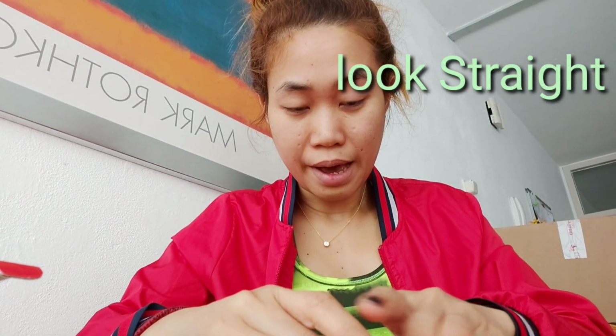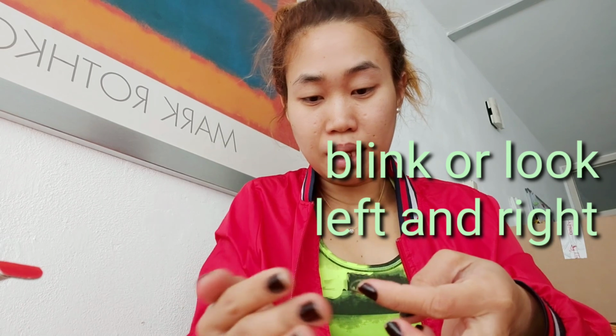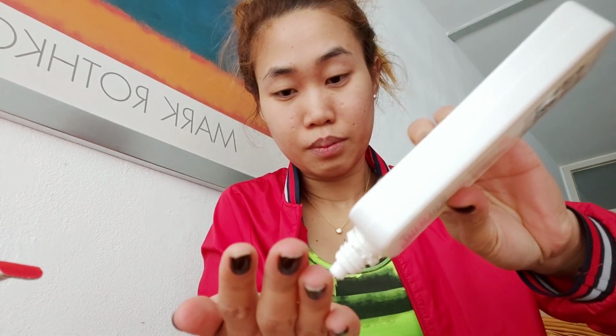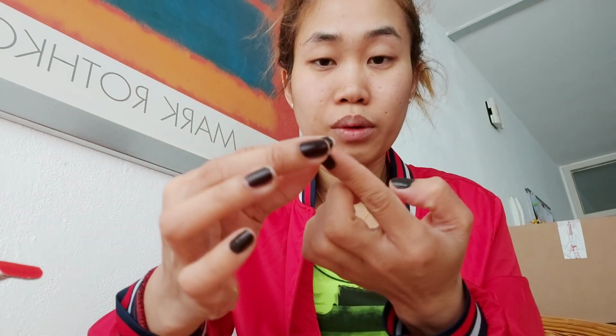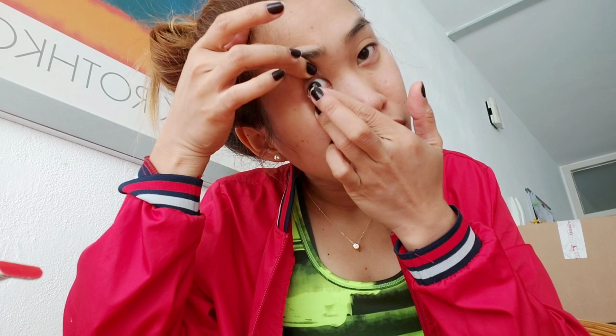Now let's proceed to the left eye. Repeat the same procedure with the solution. Sometimes, guys, you can just do it like that, but since I am making a demonstration for you, you should always try to put it like this, in the middle of your thumb and index, like that, and do it like this. Repeat the same procedure, and like that. Okay, that's all. Ooh, I'm crying.